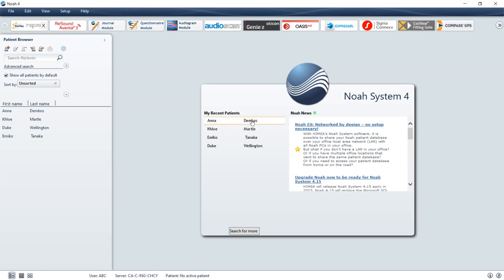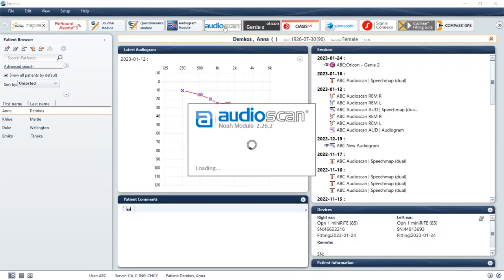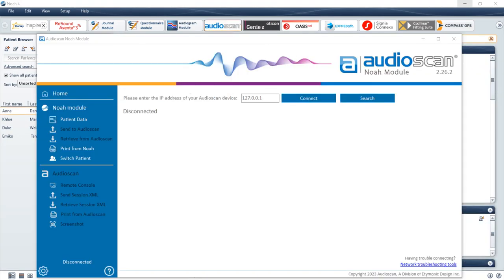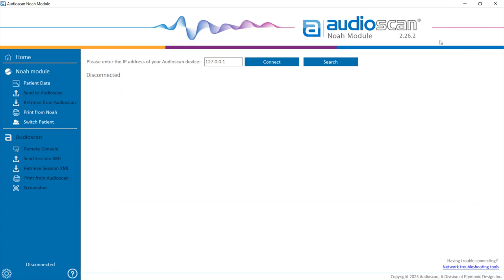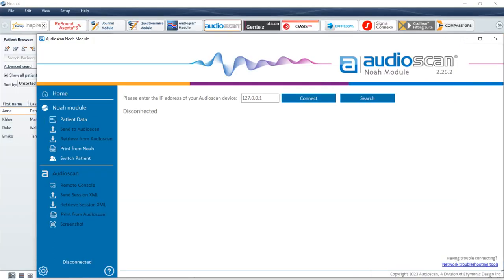Upon launching NOAA 4, select a patient and then select the AudioScan NOAA module. The user interface of the AudioScan NOAA module is scalable — you can operate the module in full screen mode or at its minimal size.